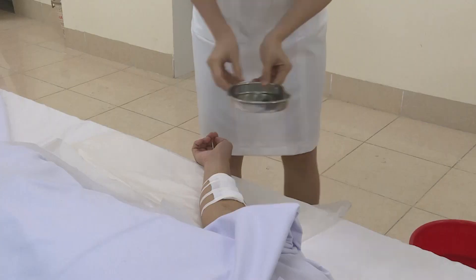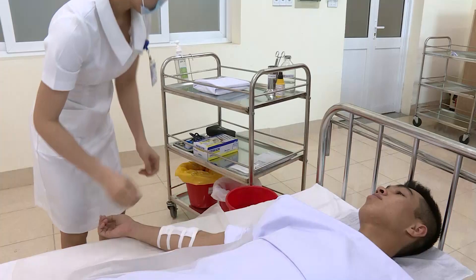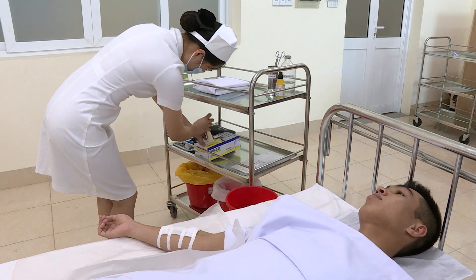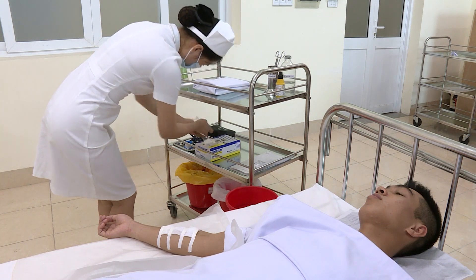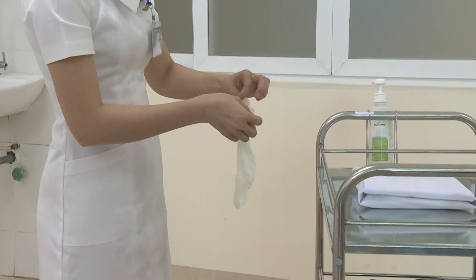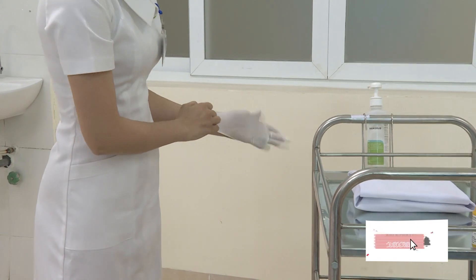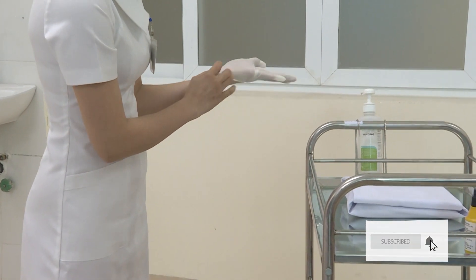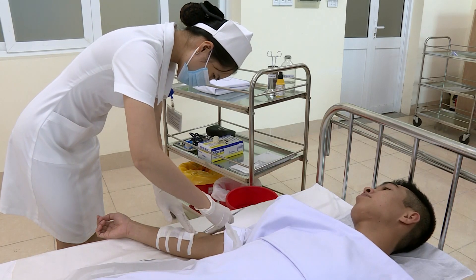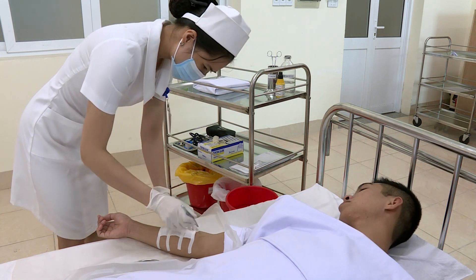Đặt khay quả đậu ở vị trí thuận lợi. Điều dưỡng mang găng tay sạch. Dùng tay hoặc kẹp, nhẹ nhàng tháo băng cũ, bỏ vào sô đựng chất thải lây nhiễm.